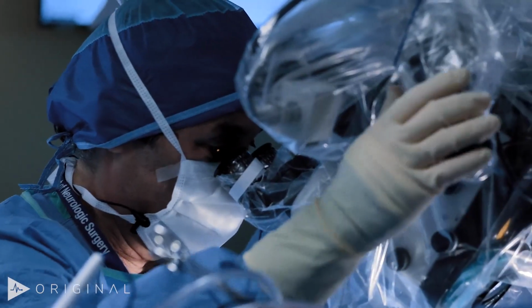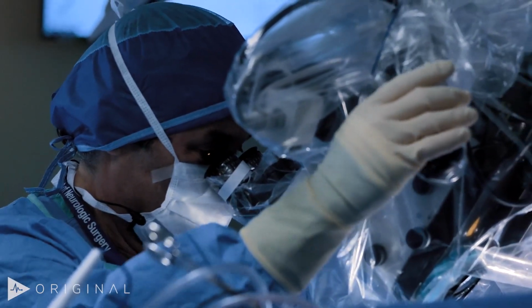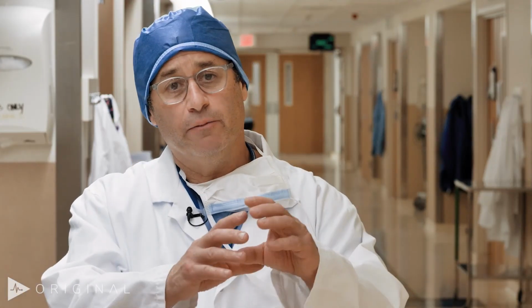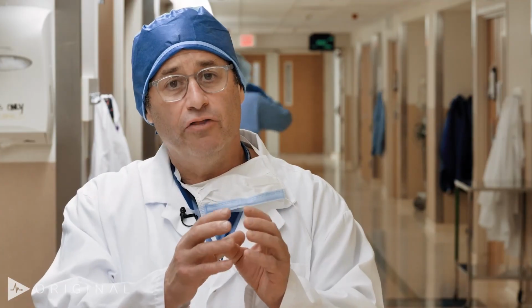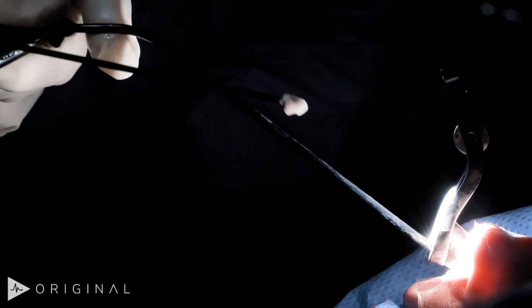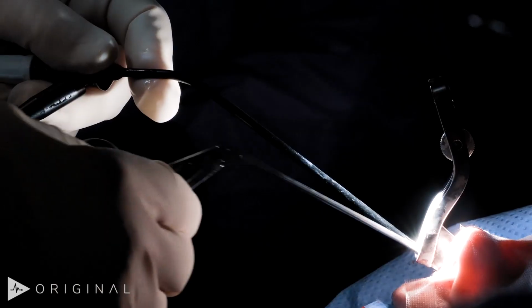Today we are going to perform a transnasal, transsphenoidal, endoscopic, microscopic resection of an ACTH-producing tumor in a young woman who has Cushing's disease. She's had an extensive endocrine workup. We're firm on the diagnosis. The trick in this patient, though, is that even though on MRI her adenoma is on the right, there's a second abnormality on the left, which raises the possibility that she has two separate tumors, or the right tumor is spreading along the front side of the pituitary gland to the left, which both of those cases would be unusual.